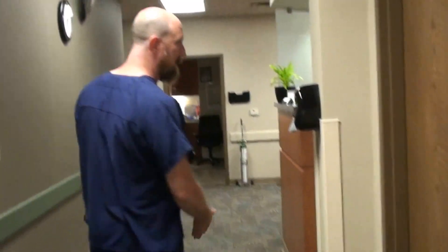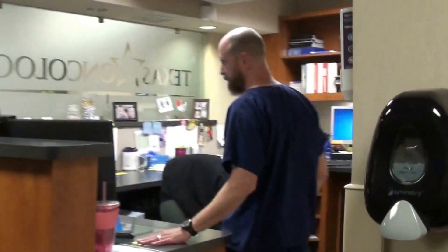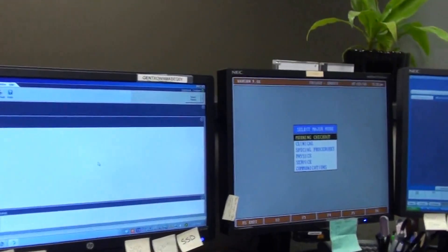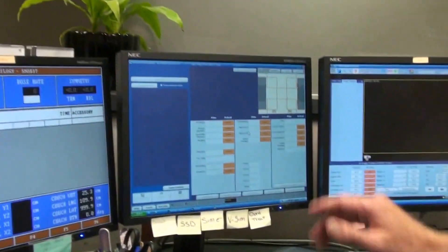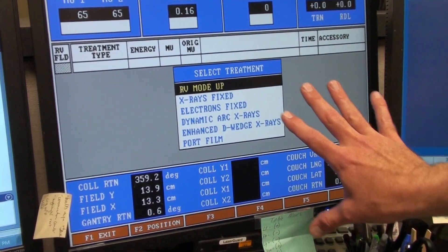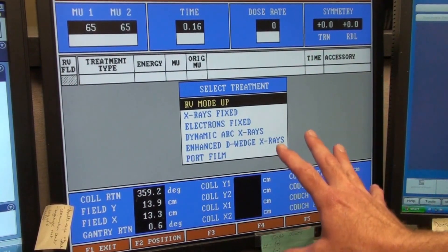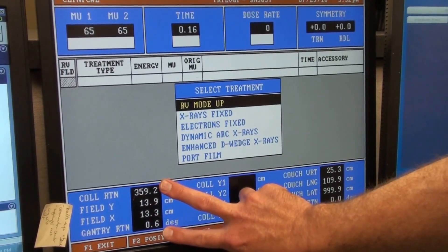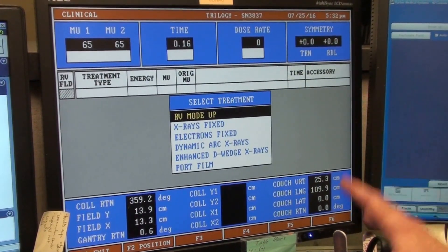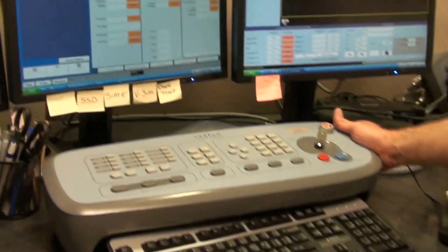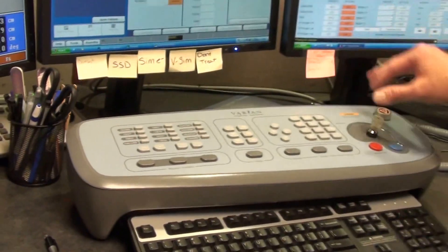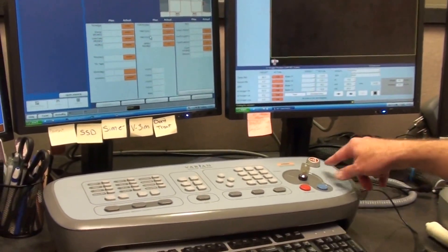As we come out to the treatment console, which is a little further out and around another corner, you can see right here we have our bank of computers. We have a record and verify system and the actual linear accelerator unit. This is our readout — where everything takes place. You can program the machine to tell it how many MU to give the patient, field size, collimator, gantry. This mirrors what is inside the room on the control panel, and gives you all kinds of other information. This is where you do the real programming with the keyboard: collimator, field size, gantry — all the same things. You also have a key lockout, a beam on button, a beam off button, and an emergency off button.